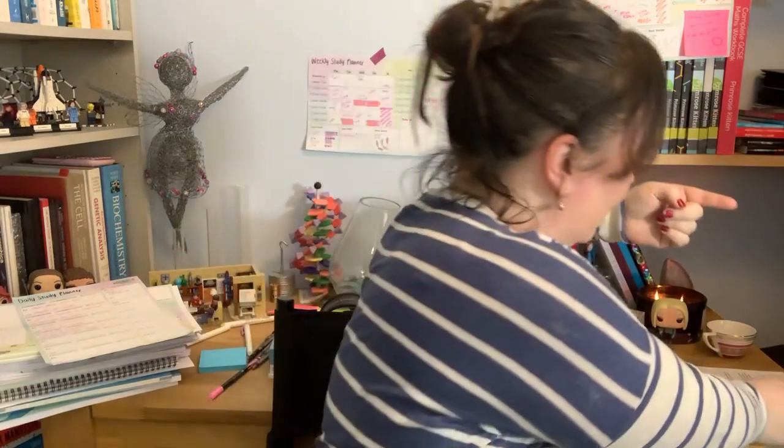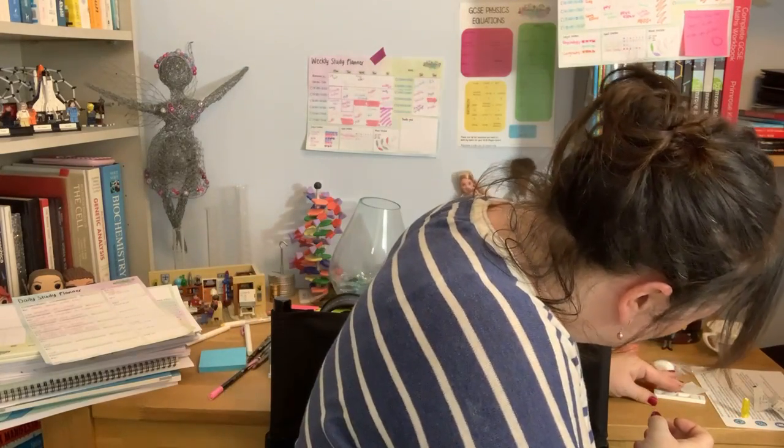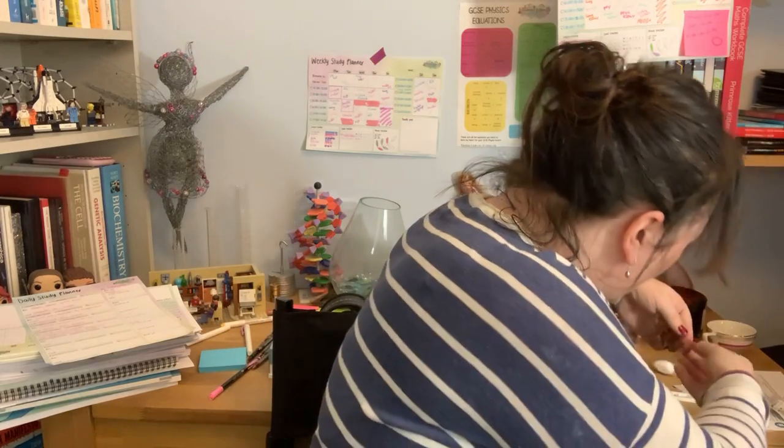Ouch, okay that hurts. I've now stabbed myself. We can see blood — I probably should put a warning on this about there being blood. I then — I have read the booklet, I promise — put a little droplet of blood. I now need to squeeze it to make a big droplet of blood. Big droplet of blood and I need to put it in the sample pot. I just need to squeeze this a bit more because I don't think this is going to be enough blood. Blood. In the sample spot.